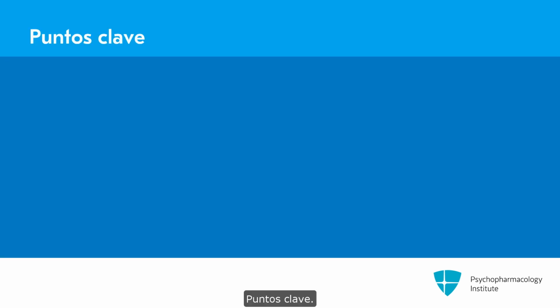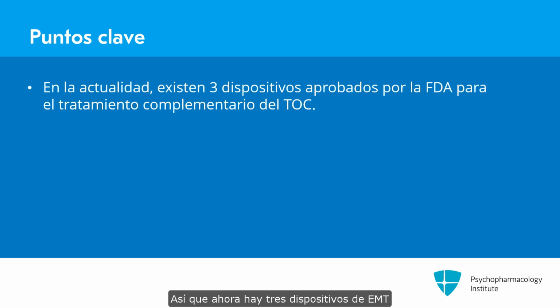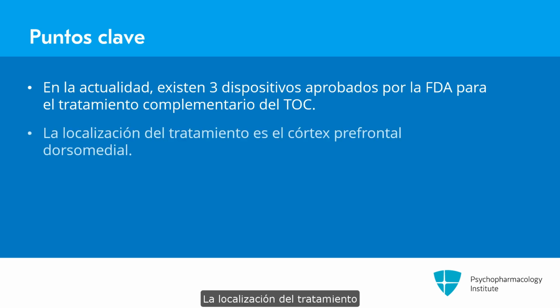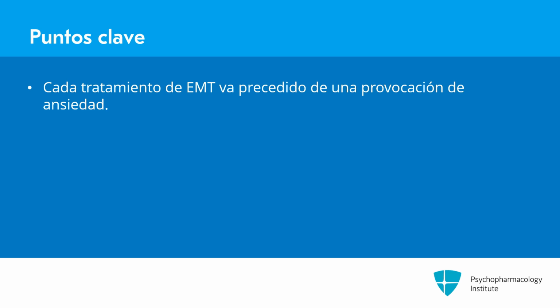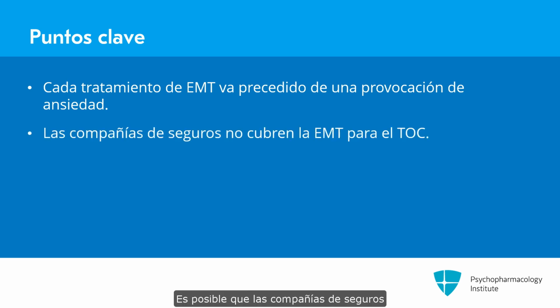Key points. So there are now 3 TMS devices FDA approved for adjunctive treatment of OCD. The treatment location is the dorsal medial prefrontal cortex. Each treatment is preceded by provoking anxiety to a level of 4 to 7 out of 10. 10 is worst. Insurance companies might not be ready to cover TMS for OCD yet.